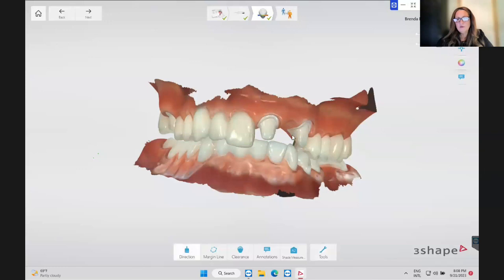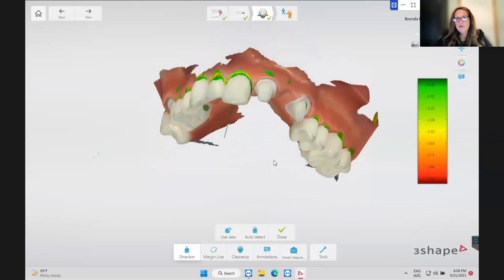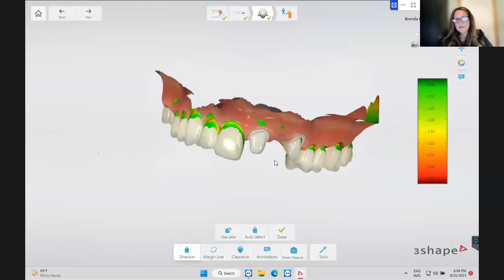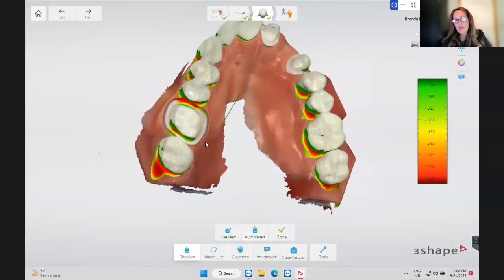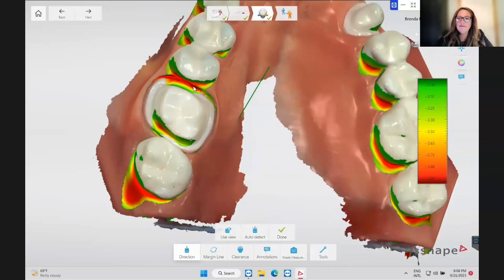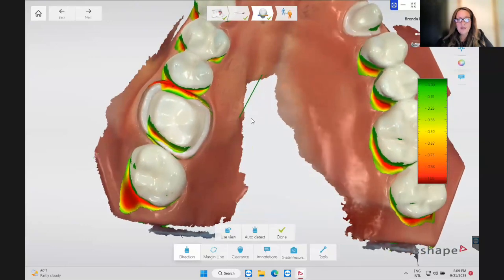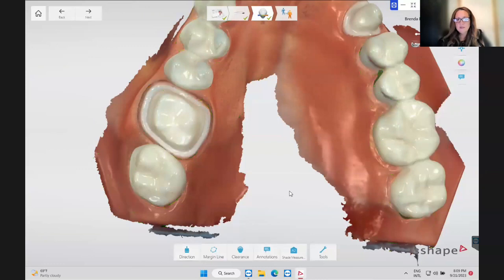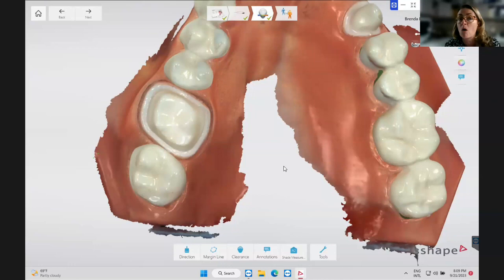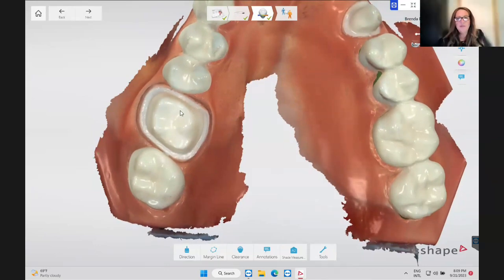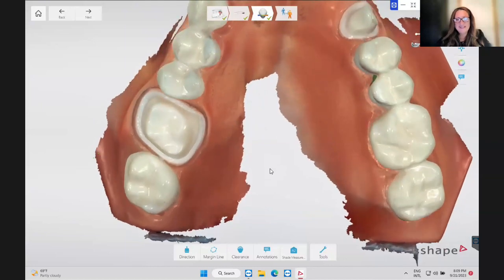The Direction tool shows undercuts. You can auto-detect them - if the prep shows an area where the contact isn't broken or you can't read your margin all the way around, you need to adjust, cut that area out, and re-scan. If it shows a small amount of red on a mesial or distal wall, typically the lab can block that out - you wouldn't necessarily re-prep and re-scan for a small amount. But if the crown connection isn't reading well, the lab will spend a lot of time adjusting.